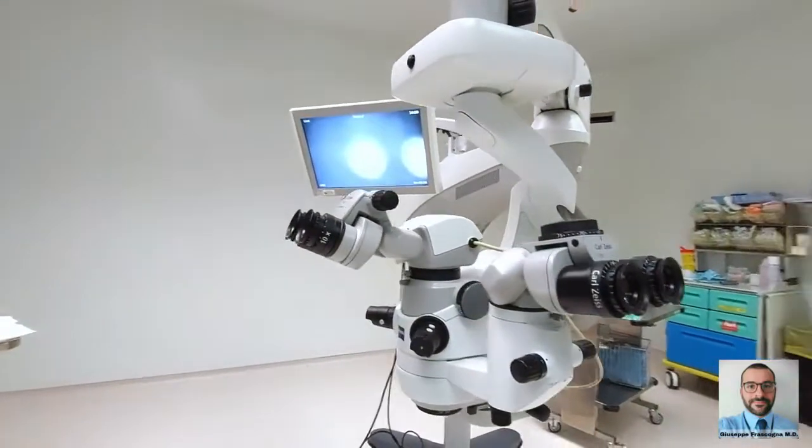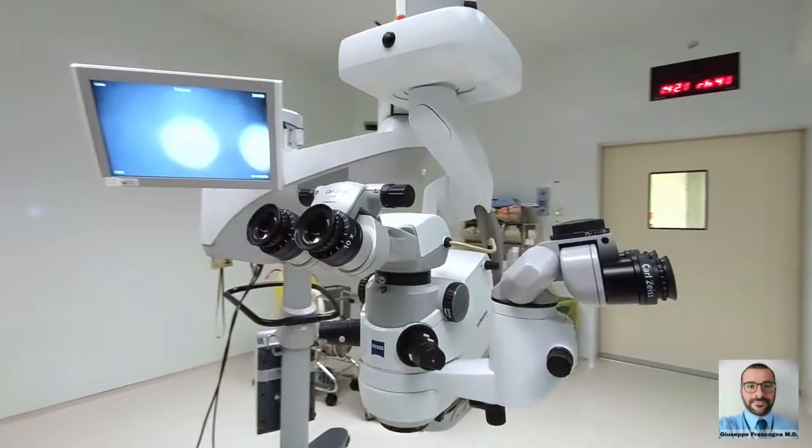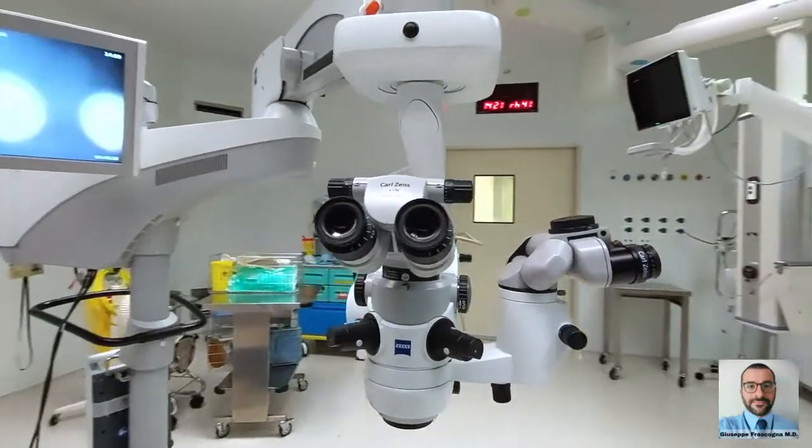In this brief video, I'm going to show you the basic setup of an operating microscope for cataract surgery.